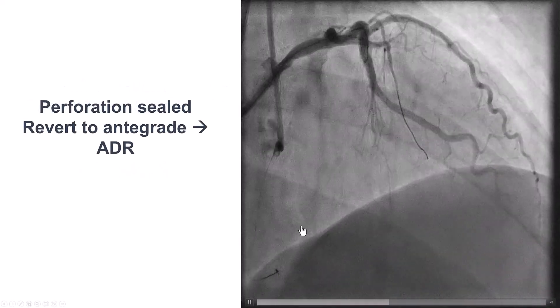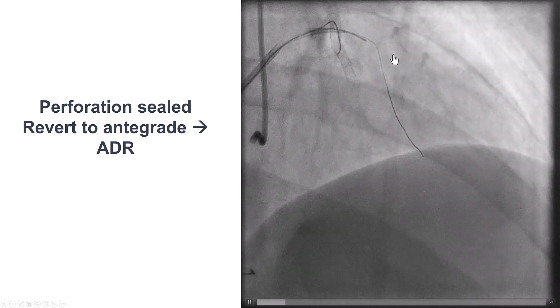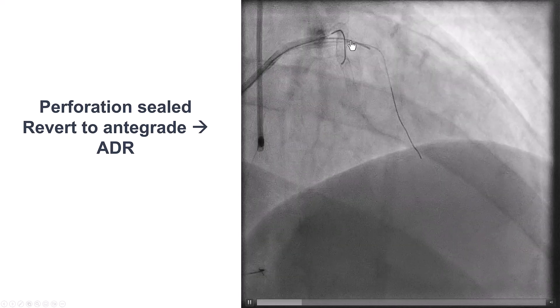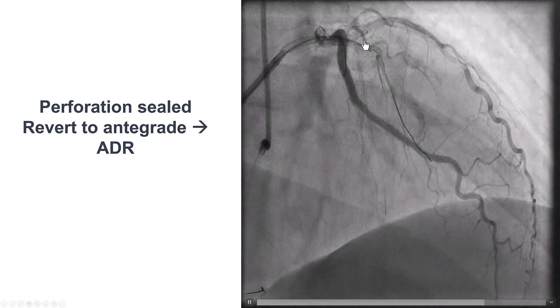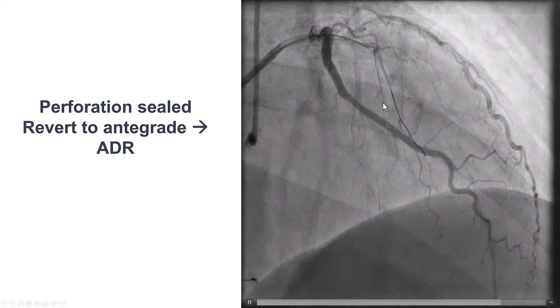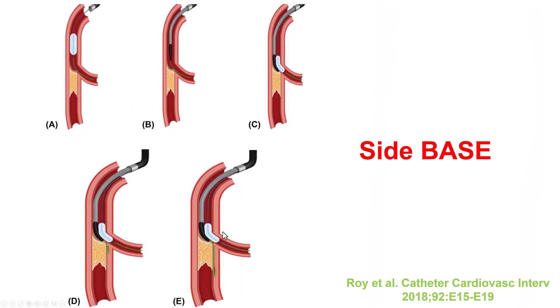At this point, retrograde had failed, and in the meantime we confirmed sealing of the area of contained perforation from before. The remaining option was the move-the-cap technique — specifically the side-base technique — in which we create a dissection proximal to the proximal cap of the CTO. A balloon is inserted partially into the side branch and partially into the main vessel, trapping a microcatheter through which a knuckled guide wire is advanced into the extraplaque space.